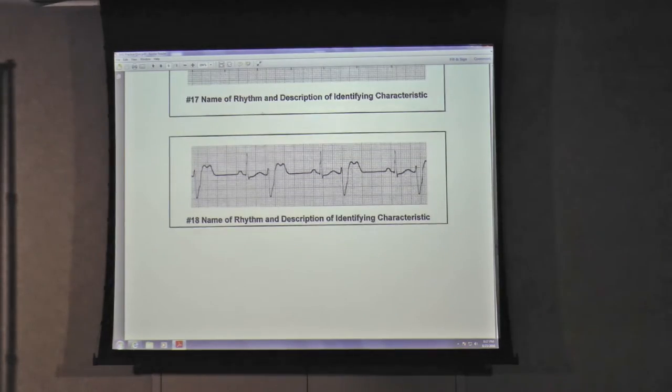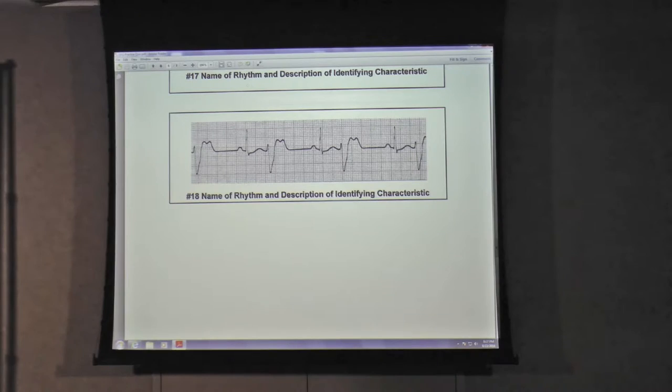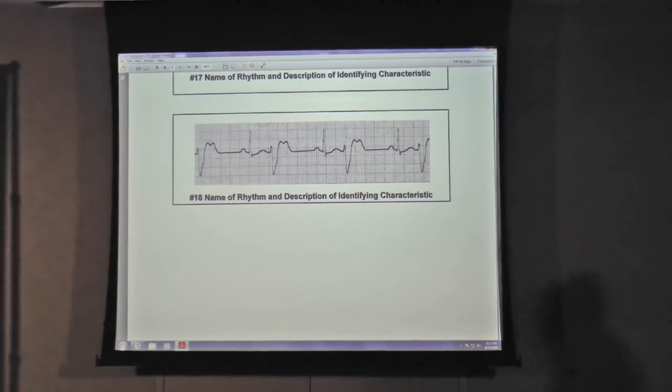And then the last one. Okay, so here we have, now the question is what are the normal ones and what are the extra ones, right? The normal ones typically are the upright narrower ones. So we have a P wave, QRS, and probably a little T wave over here. Then we have an extra beat, P wave, QRS, T wave, extra beat. But what do we notice? For every good beat, we have a what? A wide, premature ventricular complex.